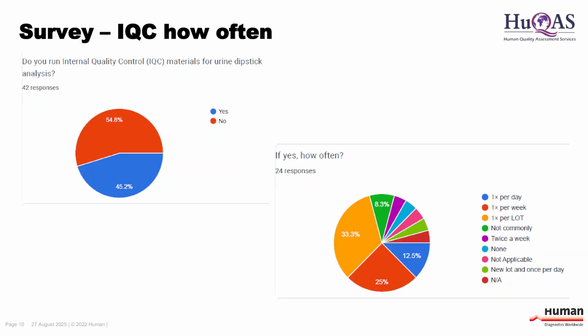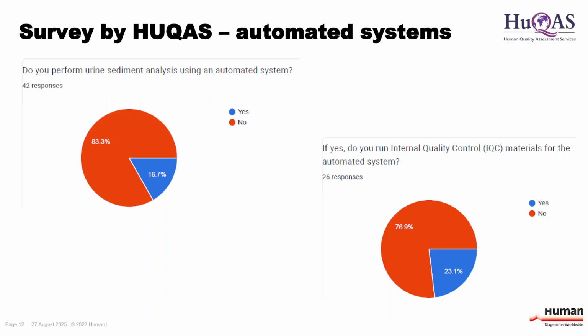And we asked again, how many of you perform QC for urine microscopy? And there you see, nobody does it. Maybe a few people who have a fully automated system will run some controls because they come with this fully automated system. For this special group, the ones who have an automated system, the QC material use is 20% instead of 16%. So if you have an automated system, this is always a step towards standardization as well, and this is what I would like to stress here. But there I would have expected the values much higher.